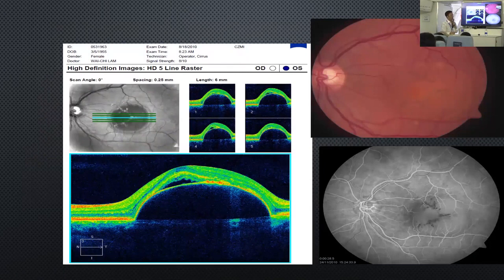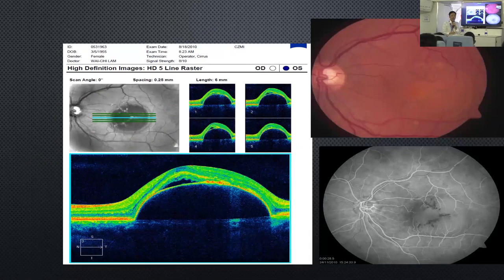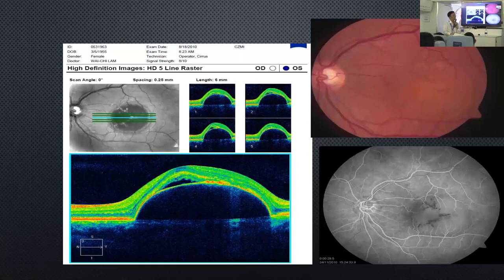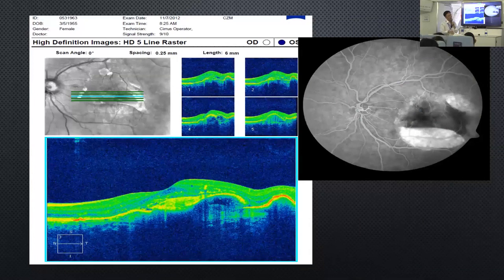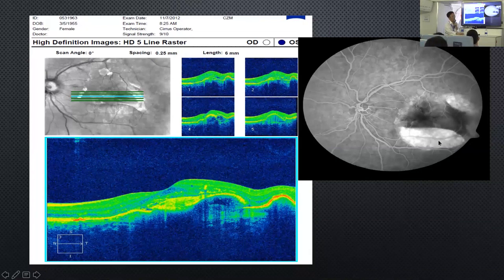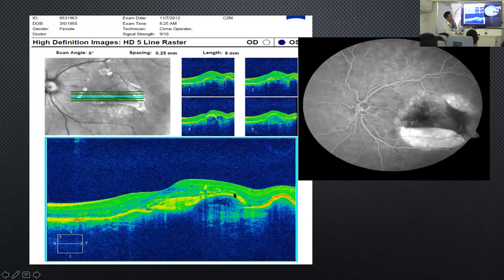When you have a large pigment epithelial detachment, it is more prone to form an RPE tear — it doesn't matter whether you inject, laser, or do nothing; it can happen. In this case the rip happened at both the top and the bottom of the RPE — it ripped on the superior pole and also the inferior pole — leaving redundant RPE, so the RPE layer is extra-thickened in that area.